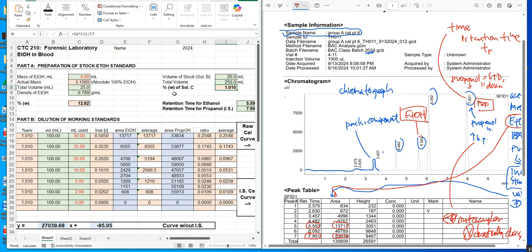Now, your lab prep might not have been the same. It could have, but it could have slightly been different. So there are changes that could happen up here in Part A based on what we did together as a group, not what 2024 did. All right, so with that said, let's figure out what these numbers represent.